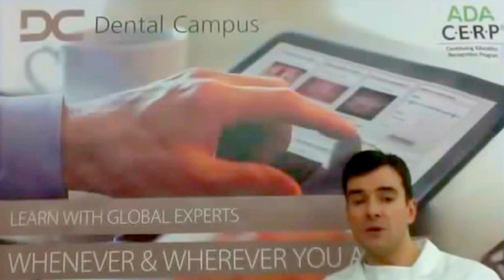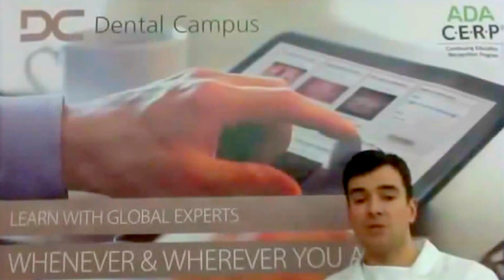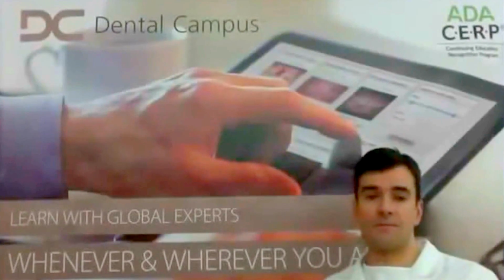In the posterior region, if you have a dehiscence of let's say maximum 1.5 millimeters, of course you can place the implant deeper. You're going to end up with a longer crown.